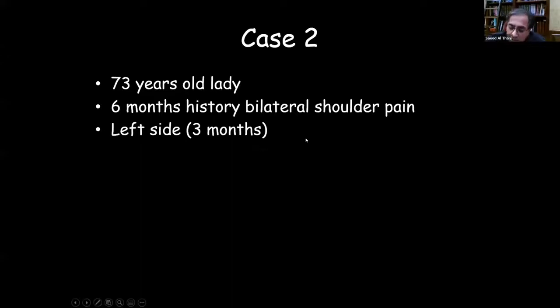So we discussed with the patient that we will tackle the new one. At least we can repair it, and we can do the reverse anytime later for the right side. We actually did this a couple of weeks prior to the Corona lockdown. So I'm following with her.